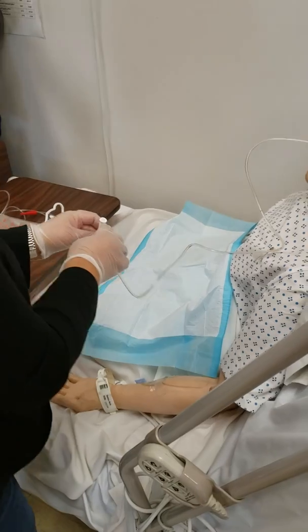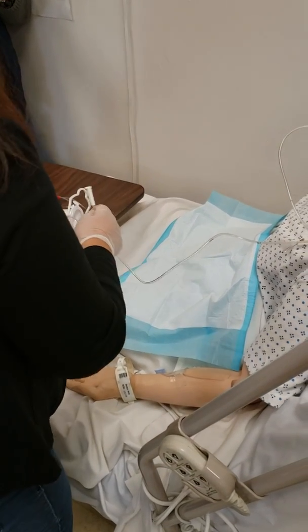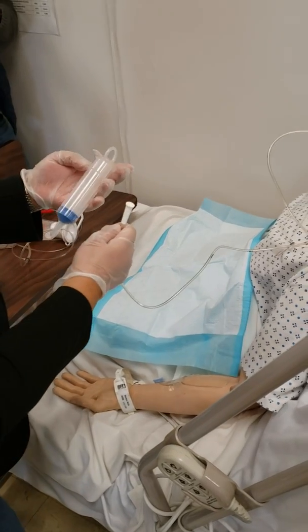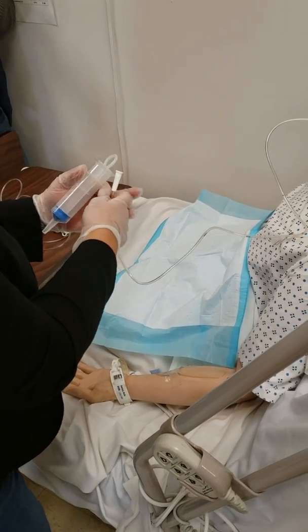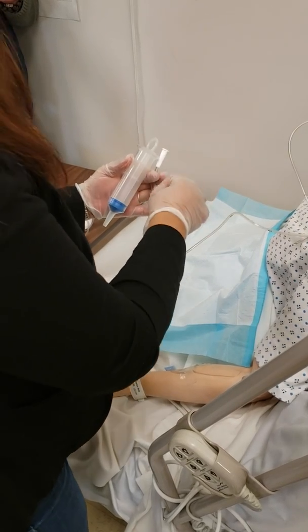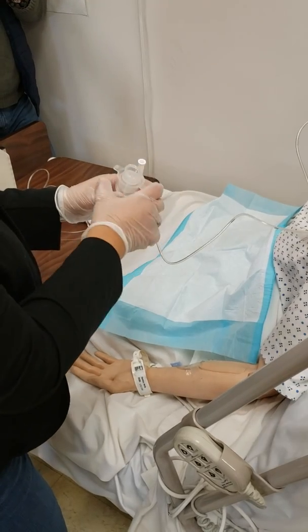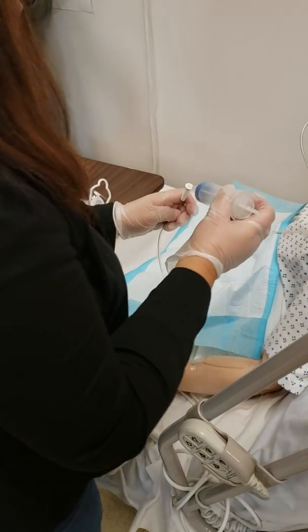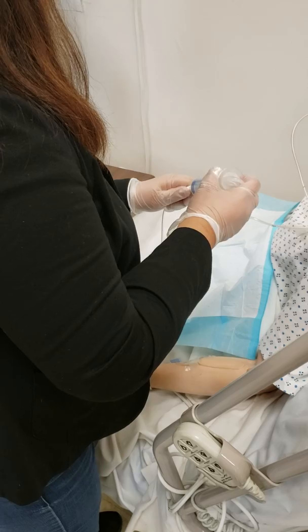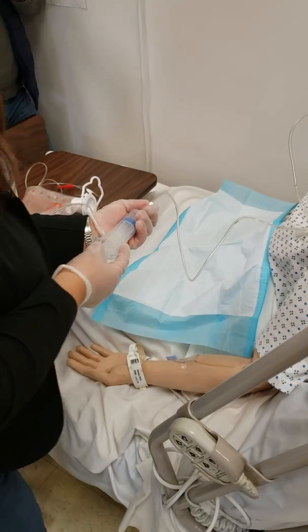So you can open it, grab your 60cc syringe, right? You can kink this. Kink it first, then open the cup here. And then you will attach this over here, and let go. And then you will aspirate.